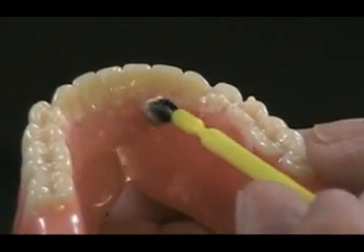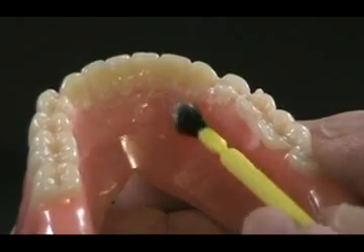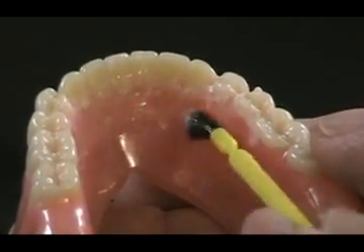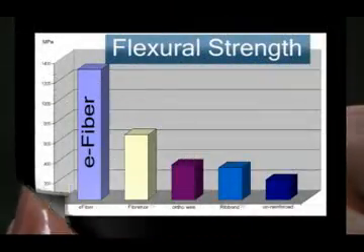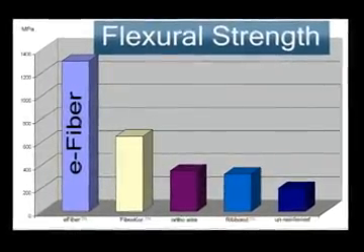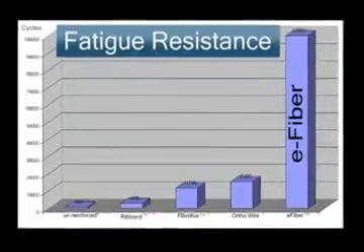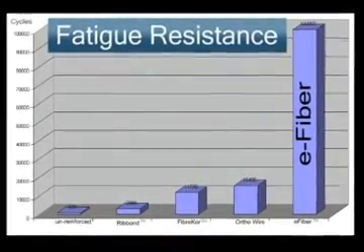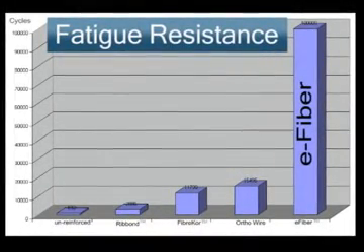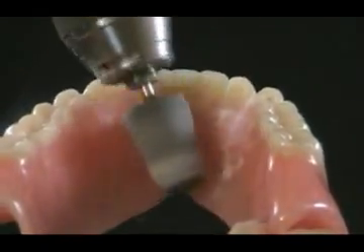An alternative is to fill the groove using the salt and pepper technique. Polymerize the self-cure resin in a pressure pot. The E-fiber has both PMMA and bis-GMA bonded to each individual fiber and therefore bonds to the PMMA self-cure resin, creating increased strength and toughness. The bonding also provides for easy adjustment and polishing, eliminating tissue-irritating surface roughness.